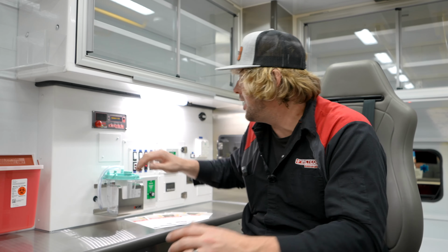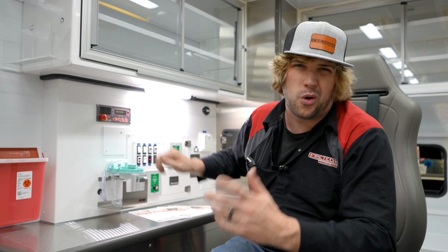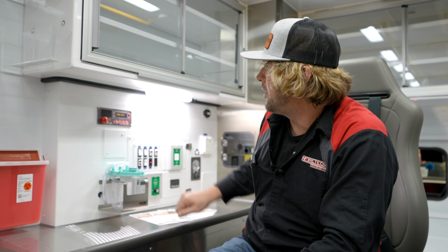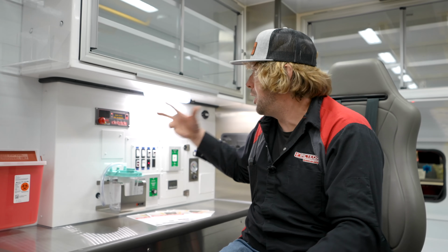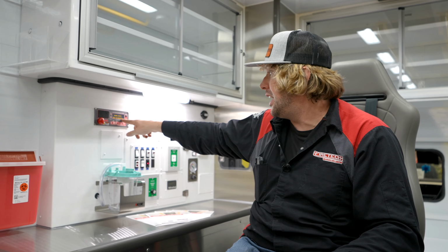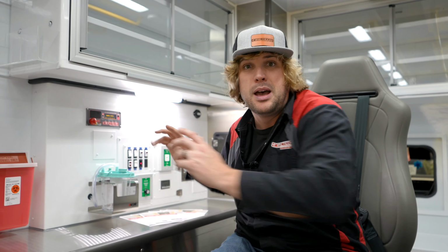But once we know the back of the truck is unoccupied and that it's safe to operate, this system comes on and it basically says, okay, I know there's been a certain amount of time. I think we set it to 3 minutes by default. Once it's empty, we run a decon system. It counts down, and I'll run the manual decon and it won't actually start. But you'll see it over here, says manual decon. Exit patient module now. It talks to you and enunciates this stuff. And it'll say exit in 36, 35. It gives you time to say, I want to manually decon and get out. This will happen automatically without you having to interface with it, but it doesn't happen automatically when you're in the truck, so it makes it hard to show off.